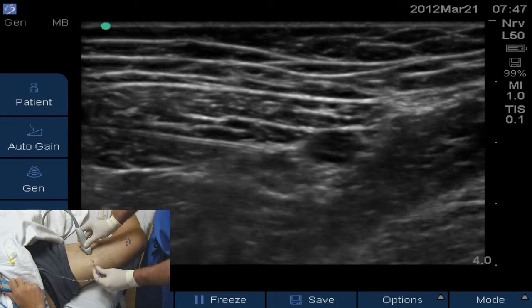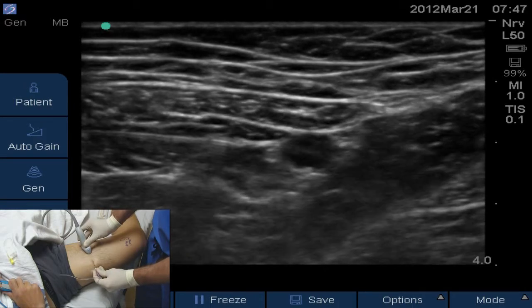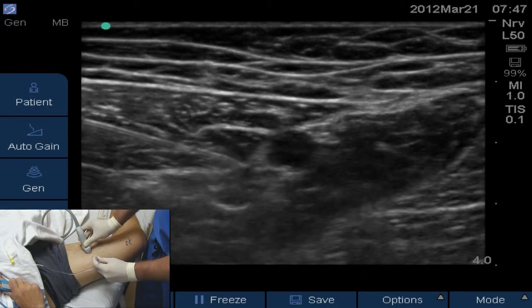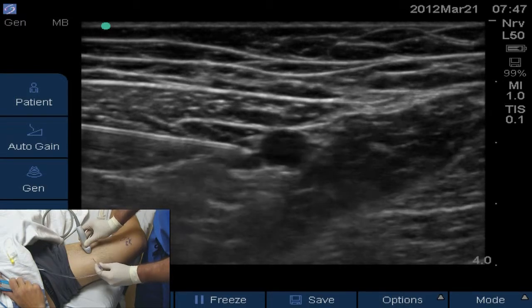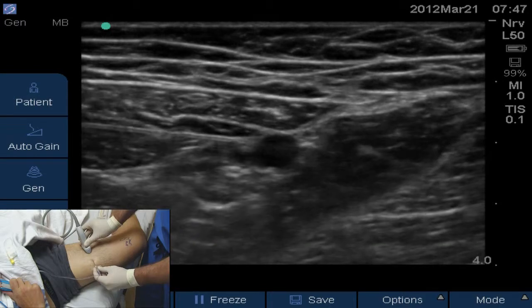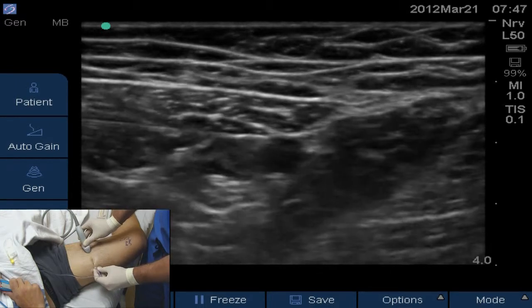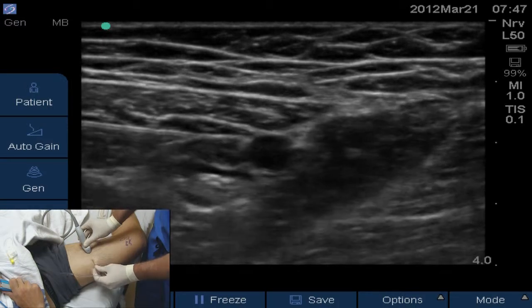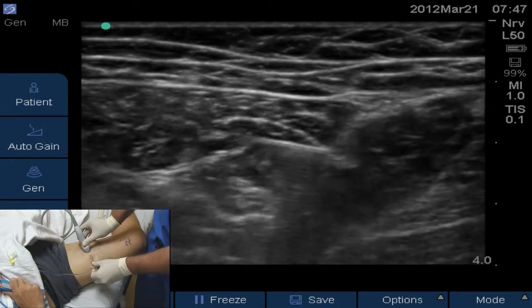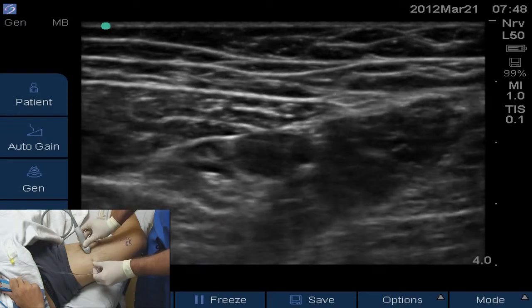Hydrodissecting between muscle and artery now — several cc's deposited incrementally. I briefly popped above the muscle again, then flattening out to peel the artery away from the muscle, hydrodissecting the muscle off the artery with the remaining local anesthetic slowly.